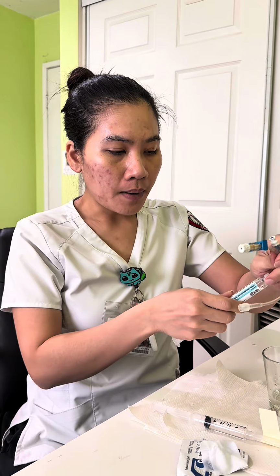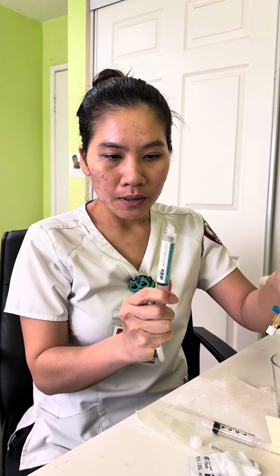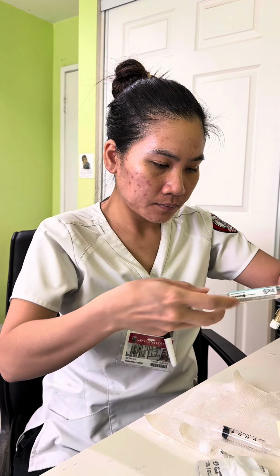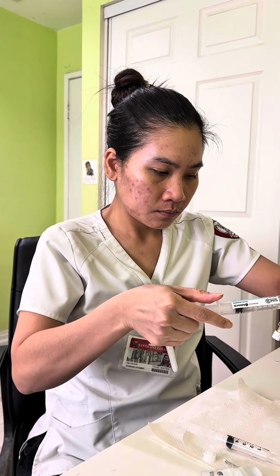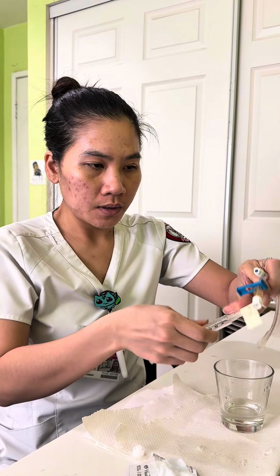Before performing the IV push, I go ahead and flush the tube to make sure the remaining fluid in the tube is out, because sometimes there is an incompatible solution in the tube, and this could give a side effect for the patient. Okay, after that, I give the patient the medication.